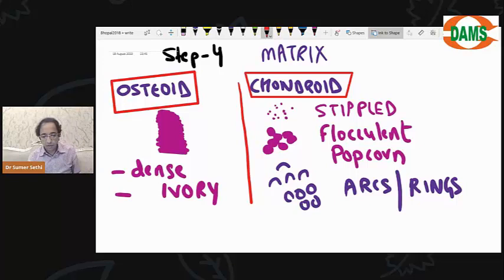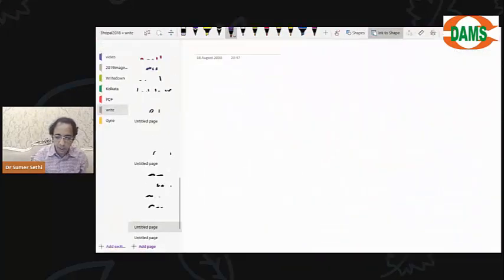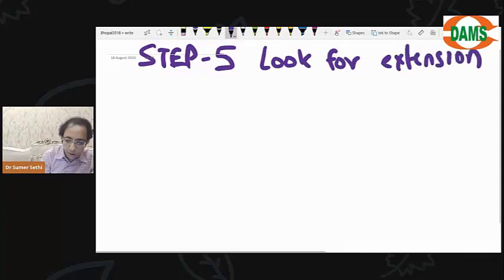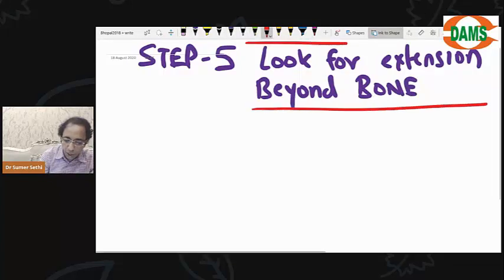Okay, now let's see if you can answer. Step number 5. कितने स्टेप थे? 5. फाइनल स्टेप आ गया. स्टेप नंबर 5. आप इसके बाद सिर्फ प्रैक्टिकल दिखाऊंगा, है ना, सिर्फ थ्योरी थोड़ा सा. स्टेप नंबर 5 इज लुक फॉर extension beyond the bone. जो हम बीमारी देख रहे हैं, is it limited to the bone or is it outside the bone also?